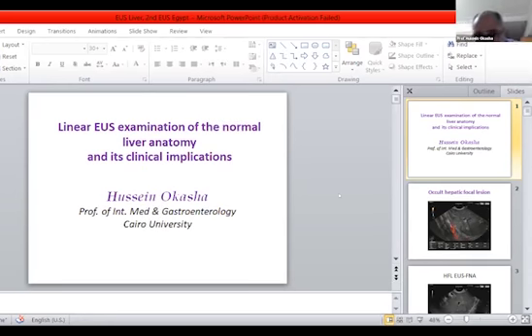So then I think, if you can illustrate to us, because we tried to do this exam of the liver, and I really loved your lecture on how to do the tail exam and not miss any part. This was very informative, and it is a good quality exam, and I think we should push for that. But sometimes these occult lesions are so hard to detect. Can you give us some clues about how you see them? Because sometimes you would miss them, and we send patients for Whipple, and they find that they have liver lesions. A lot of times they're almost isoechoic. What's your experience with these almost isoechoic liver mets?